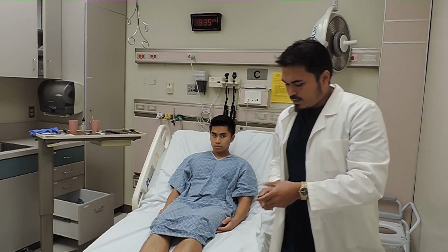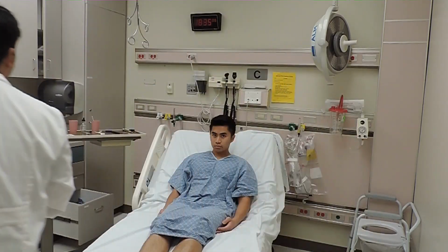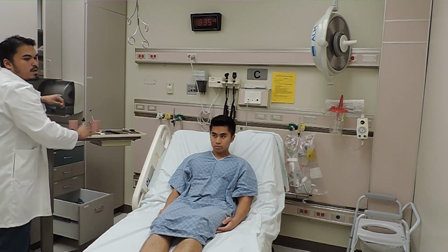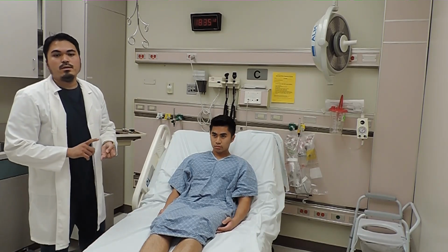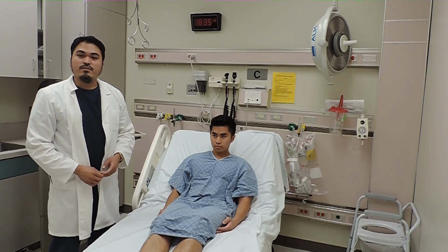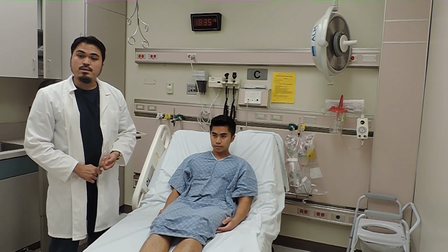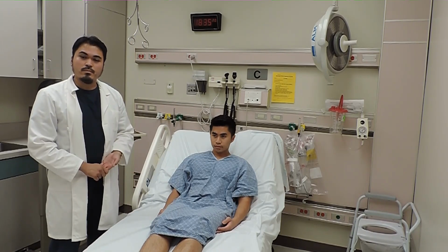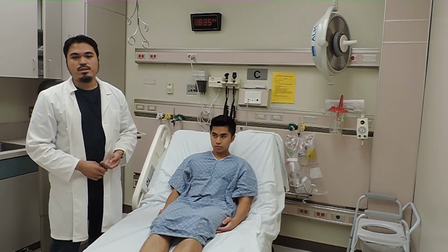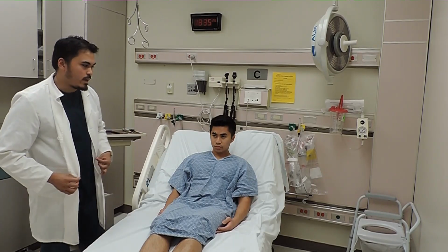All right. I see that the ear canal is pink. There's no excessive drainage. There's no cerumen. I see the umbo, the light reflex, and the handle of the malleus. I also see the tympanic membrane is pearly gray. There's no perforation or signs of inflammation such as redness or swelling.